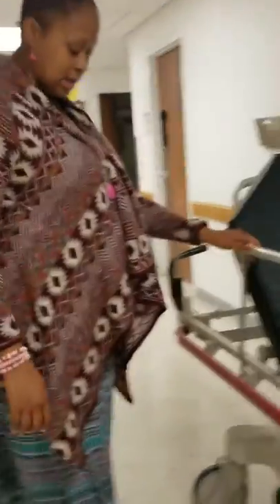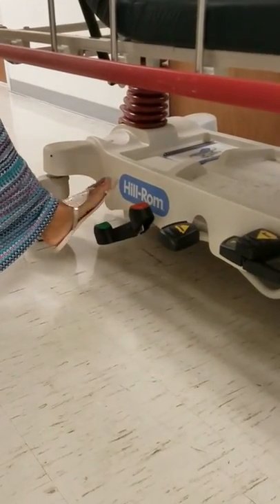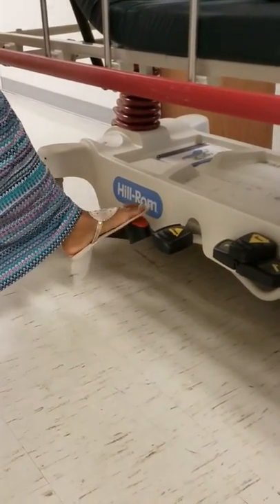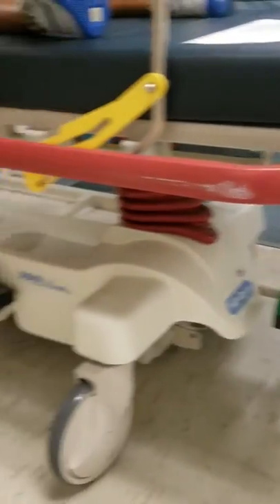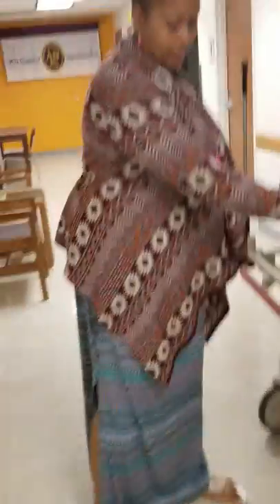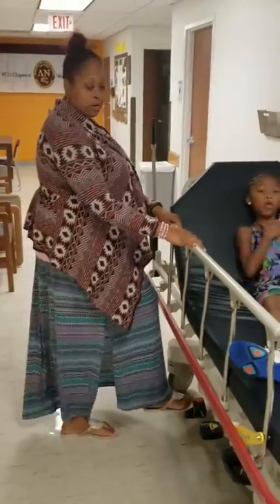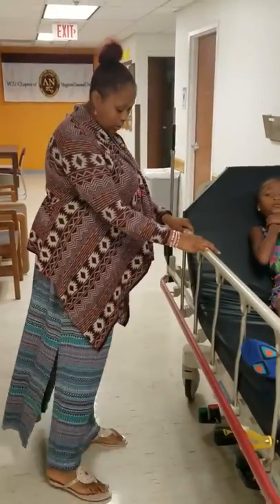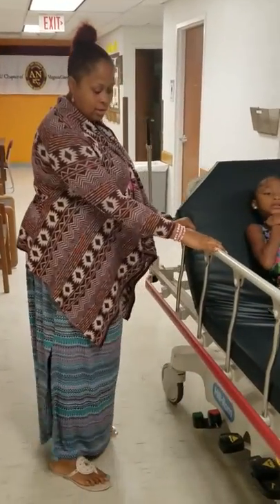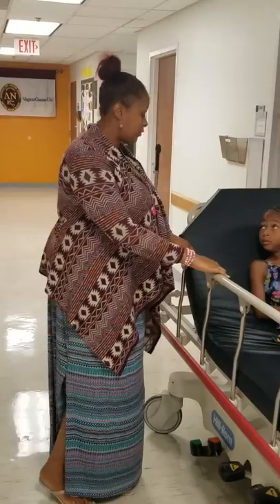The next thing you'll have to do is take the brake off, which is located here. If you put it in the middle, it allows the wheels to move in a circular motion. If you put it going all the way back, it allows the stretcher to be steered.